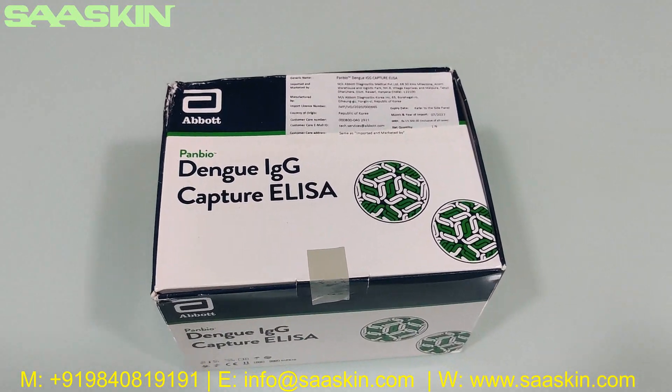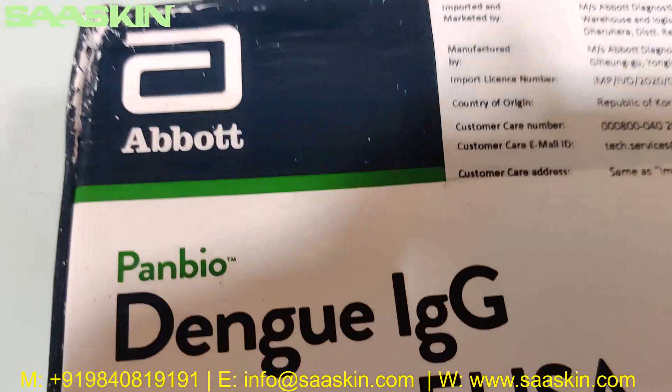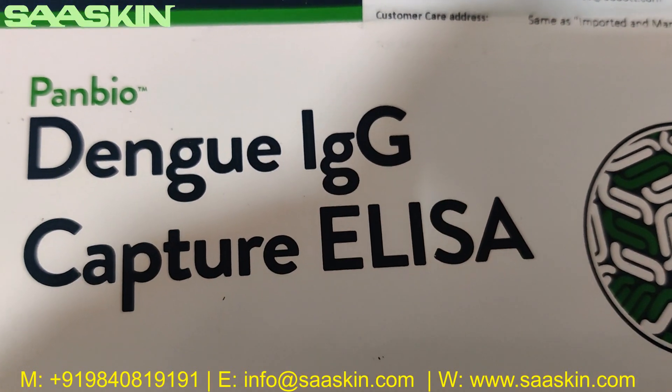Hello everybody, today we are going to see the unboxing of the Abbott Panbio Dengue IgG Capture ELISA Kit.